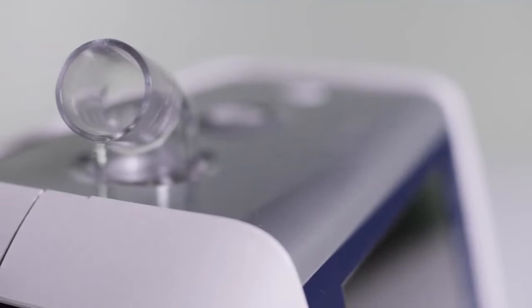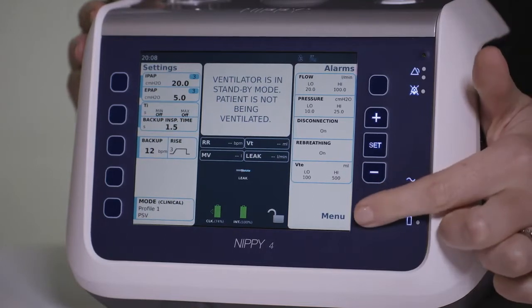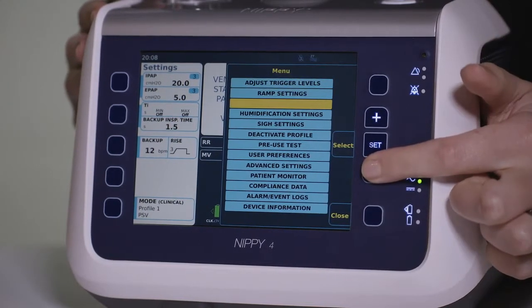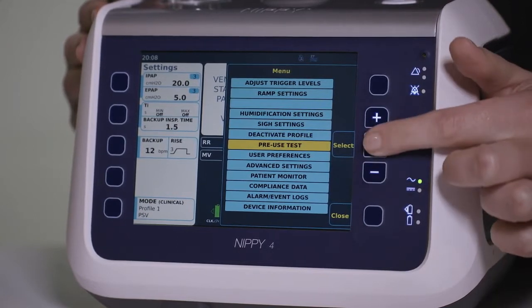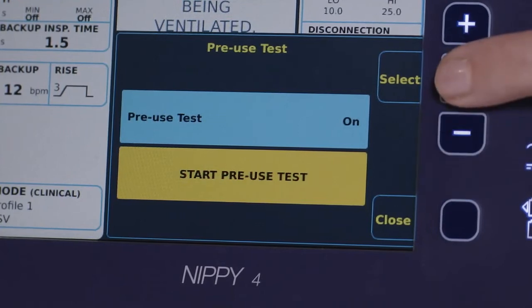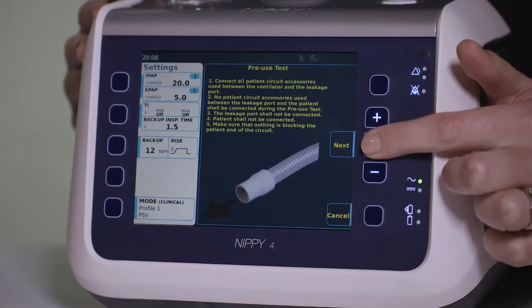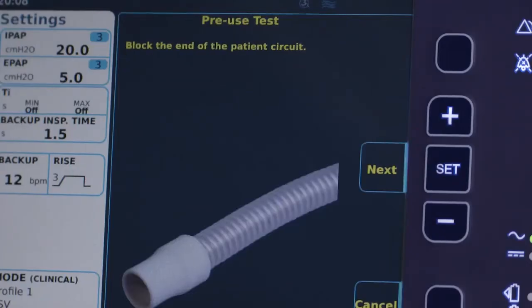Before setting the device up, we recommend you complete a pre-use test of the circuit you are using. To do the pre-use test, enter the main menu via the bottom right button and select the pre-use test option, followed by start pre-use test. Follow the on-screen instructions to complete the test in order to calibrate the device for use with the breathing circuit you are about to use.